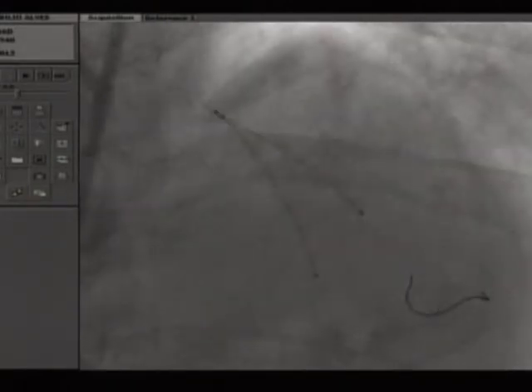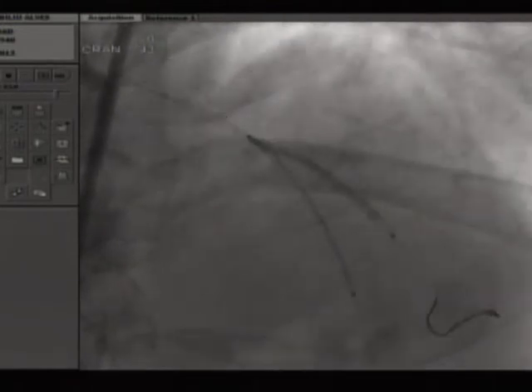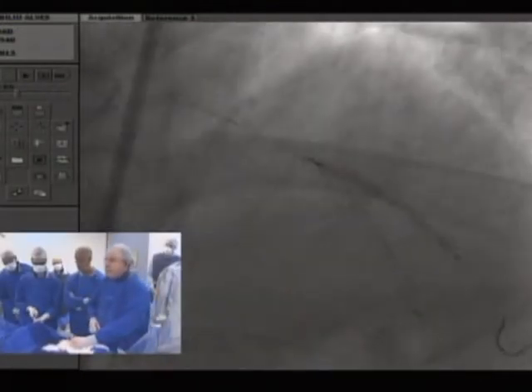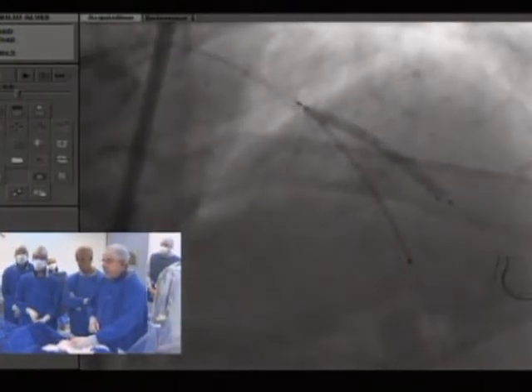See, you have many layers now when you rewire. That's always one of the difficulties here, deciding where you're at. You've got the heart that's moving and trying to position both of those. And the distinction between crush and mini crush really is a matter of millimeters, 1 or 2 millimeters. Inflated to 12 atmospheres at the diagonal.